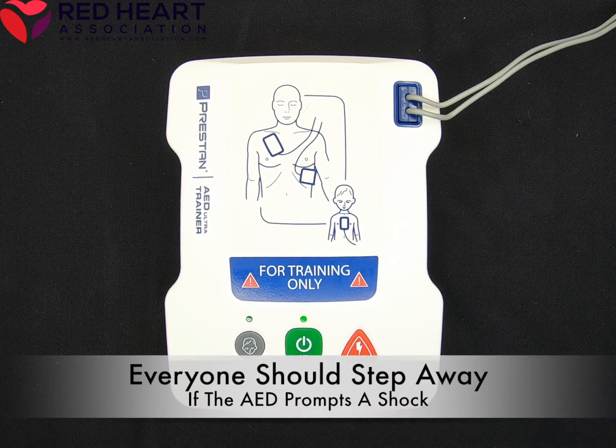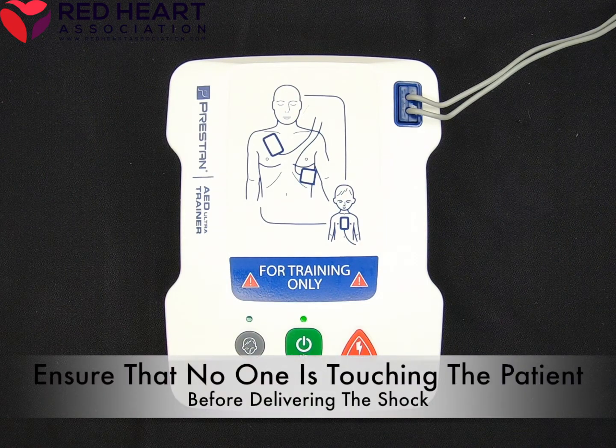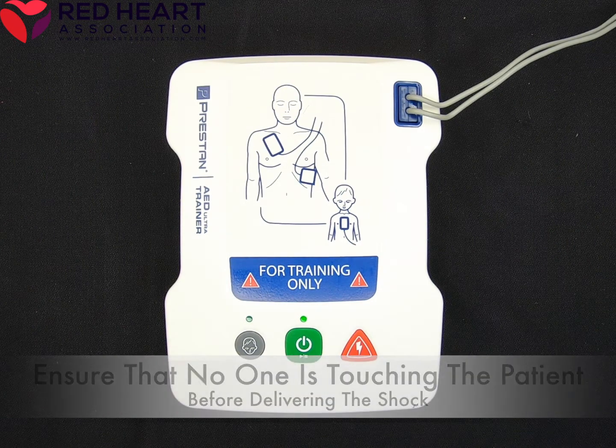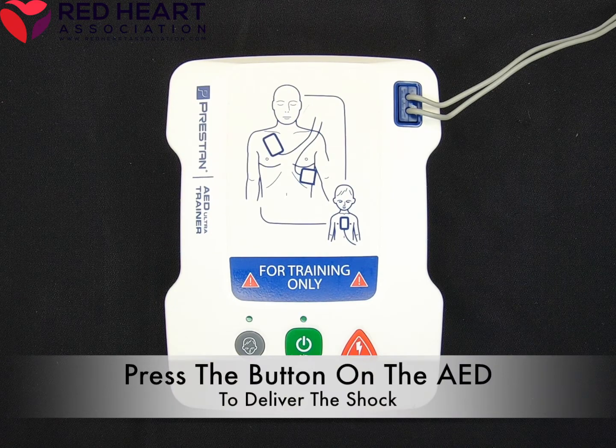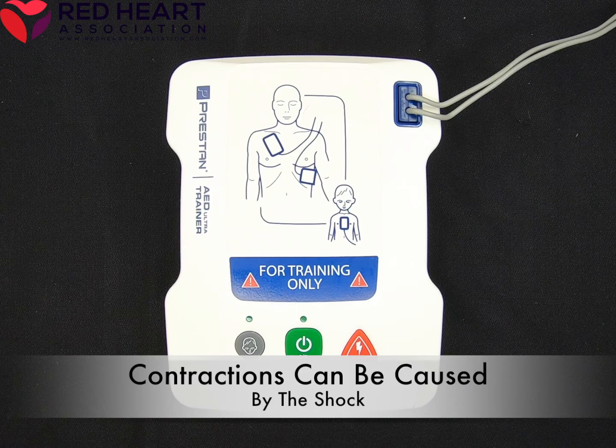At this point, all persons should be prompted to step away from the patient. Ensure that no one is touching the patient. Press the button on the AED to deliver the shock. The shock may cause contractions in the patient.